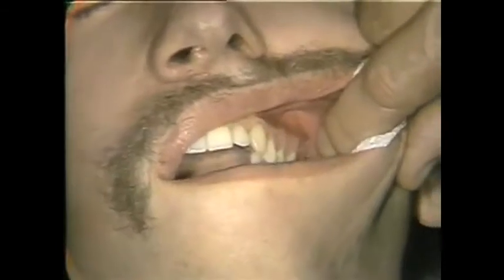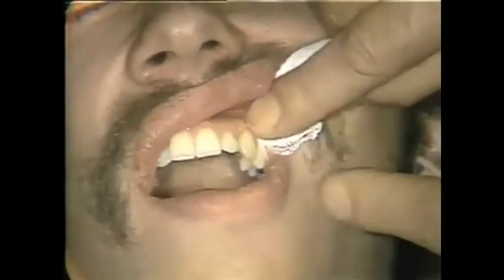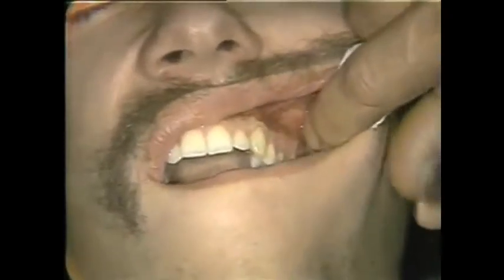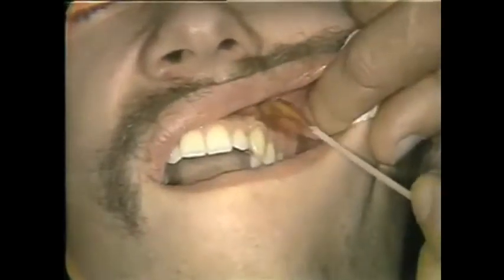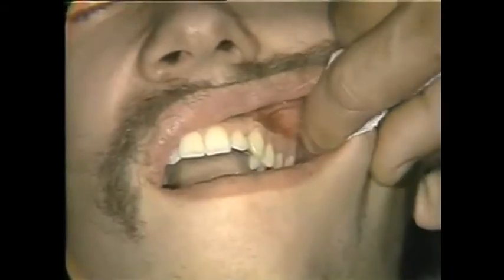This is very similar to the molar infiltration, with the exception that we're going to change the position of our needle bevel over the apex of the bicuspid instead of the molar. Just close a little bit for me, and fine. We'll dry the mucosa again, and let us show that we're going to anesthetize the maxillary first bicuspid. A little tincture of betadine on the mucosa.